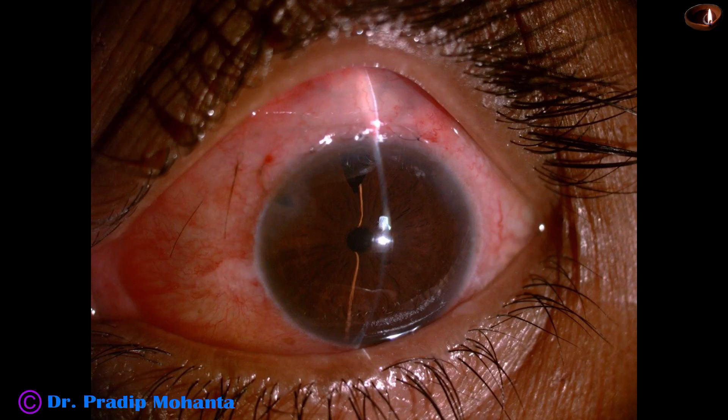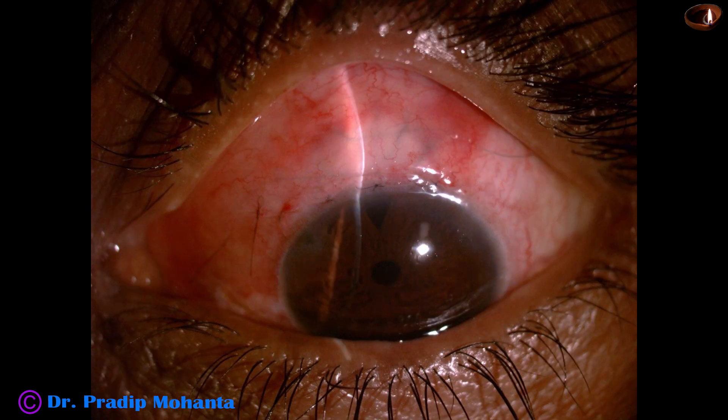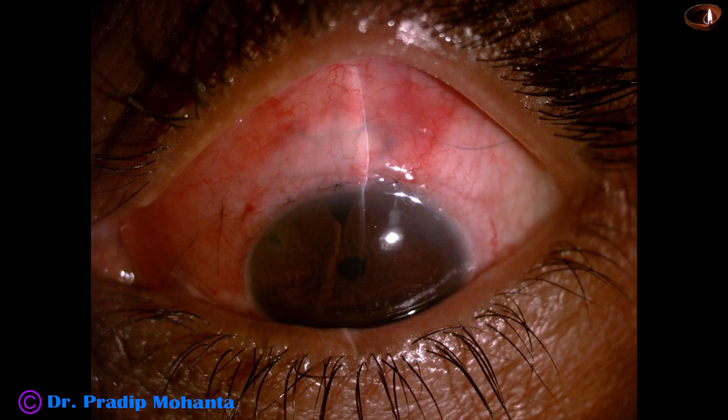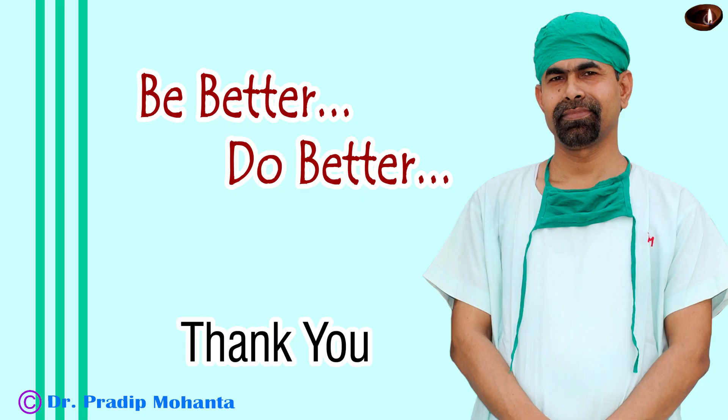Here are some post-op pictures. See how quiet the anterior chamber is — the pupil is small because I used pilocarpine. The cornea is clear. See the bleb — how beautiful is the bleb. The intraocular pressure is 16 mmHg. Unaided vision is 6/12. There is no corneal edema anywhere. And the patient is very happy. Thank you very much for your attention. Hope this video will help you in developing your surgical skills. Please do phaco-trab in patients with cataract and optic nerve damage going to glaucoma.